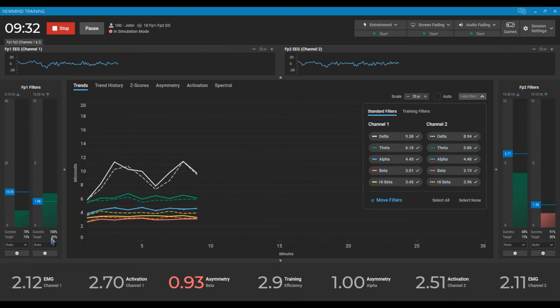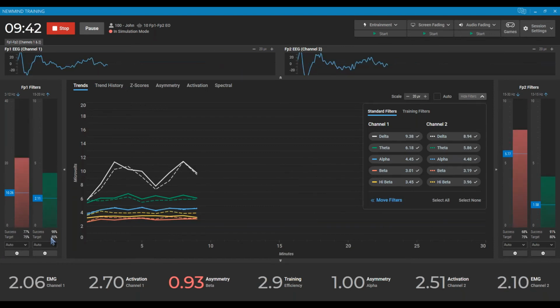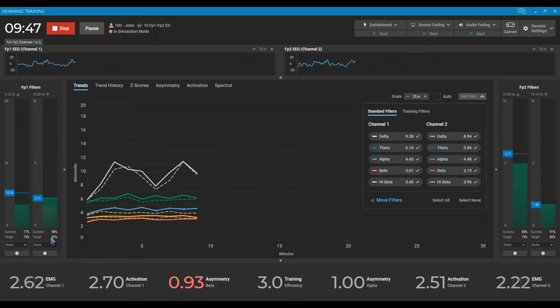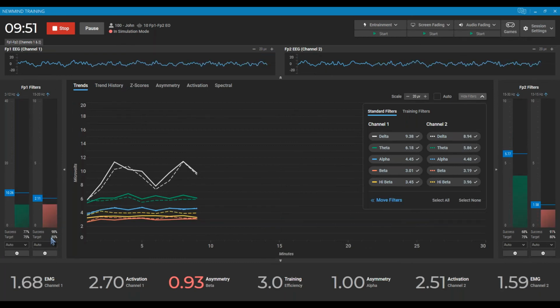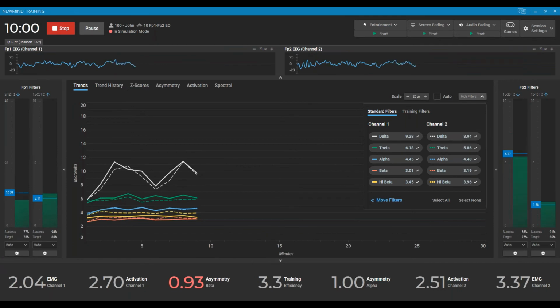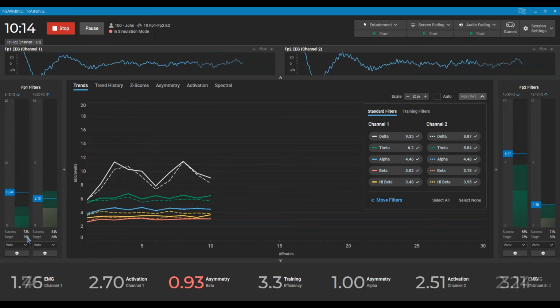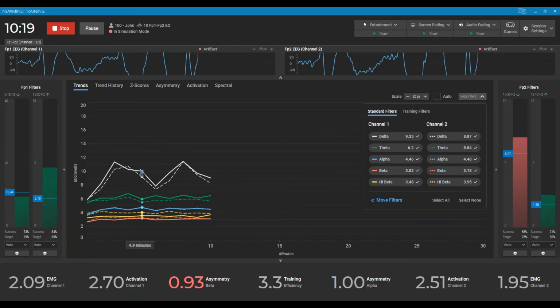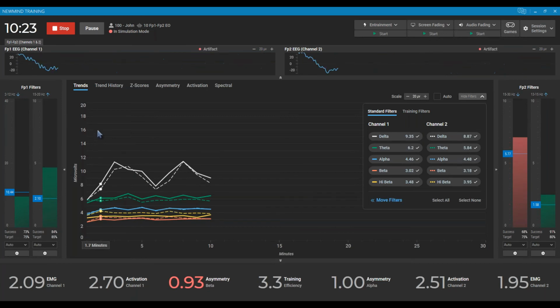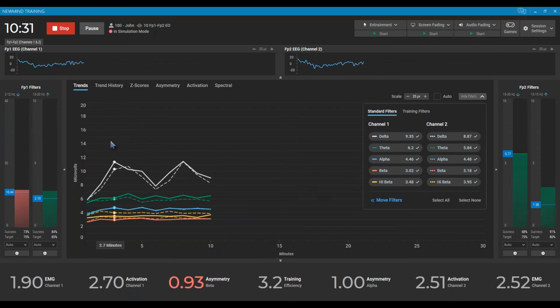Now, on the opposite side of that, I had some younger clients, in the 20-year-old range, extremely healthy. They worked out, played sports, were eating a good diet. And I had one in particular, a 21-year-old male. Mom had brought him in, and I started playing with his target percentage one day, and I took him all the way down to 65 across the board. And it seemed every time I would go 5% lower, and at that point, I think with him, I was training his delta down. So I think when we started, he was up like 14 to 16 microvolts, if I remember right. And I made the first adjustment from 85% down to 80, and I watched that line just dip down about 3 more microvolts. And then I moved another 5%, and I saw it dip down again, and I stopped at 65. Figured that was enough.